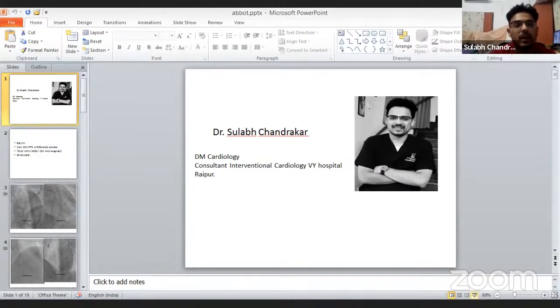In the caudal view, his left main was normal, distal LCX was 100%, ostioproximal LAD was normal, but after the ostioproximal part there was mild plaque. In the cranial view, we can see that the mid part is diffusely diseased, and two large diagonals are coming, which are supplying a significant part of the myocardium, and both the vessels are definitely greater than 2.5 mm. This was the right side. The right side was more or less normal. Plaque was there in the PLV. With this background.